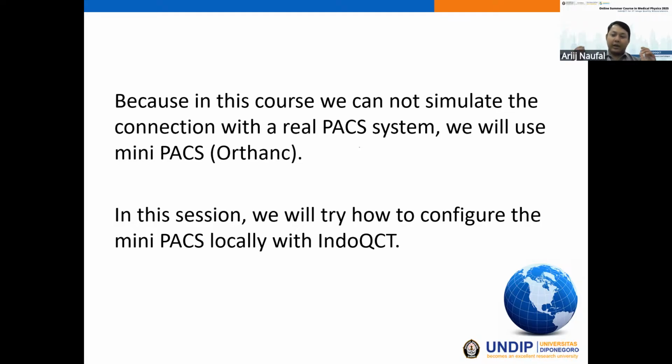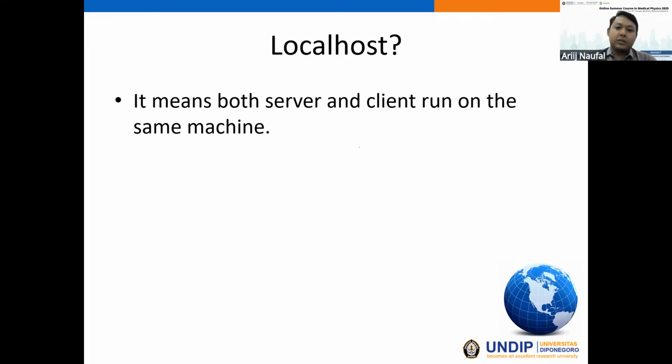We understand that this is highly technical, so we hope you will follow us through. In this session, we will try how to configure the mini PACS locally with IndoQCT. So what does it mean to be a localhost connection? It means both the PACS server and the client, IndoQCT, run on the same machine.